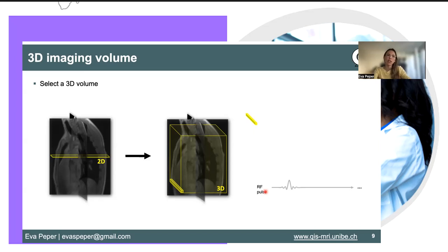You will acquire this single data point, first of all, by applying the radio frequency pulses that you have with MRI. You apply that, and you will then consecutively detect a signal of the relaxation process that is happening afterwards. So far, so good. That's very basic MRI imaging.